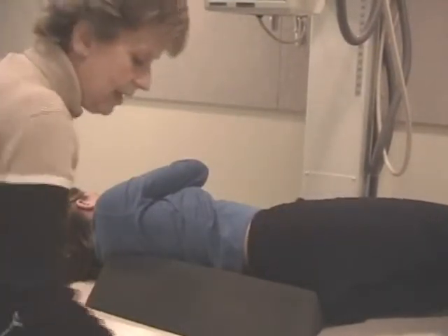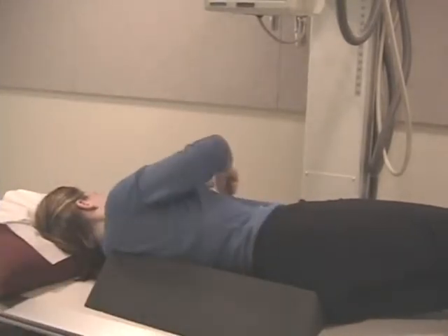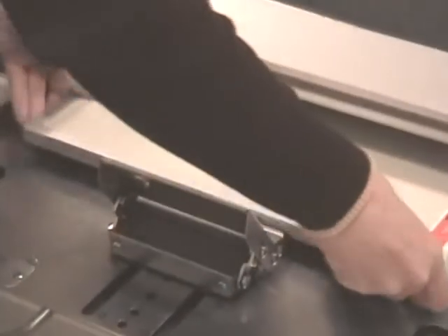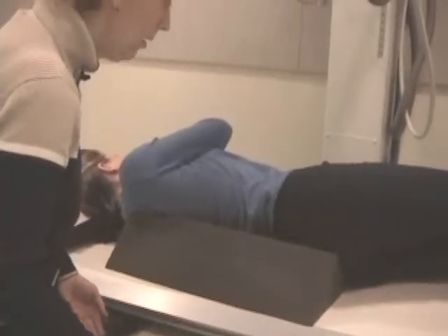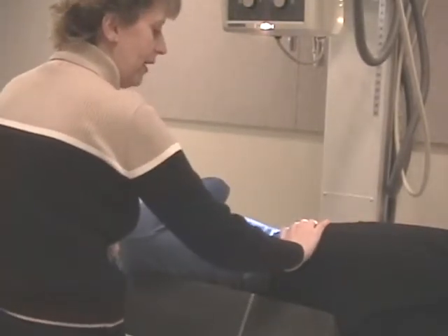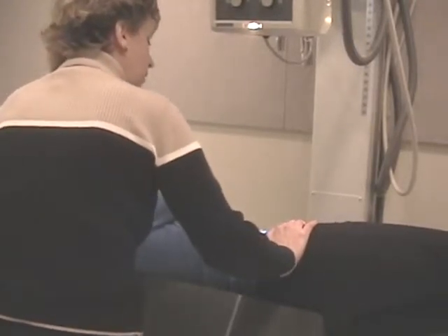I'm going to change cassettes. And I'm going to use a left marker now, moving it in a ways. ID blocker to the bottom. I'm going to be demonstrating the left zygapophyseal joints now. Same collimated field, and I'm going to palpate for her ASIS, be approximately 2 inches medial to that.